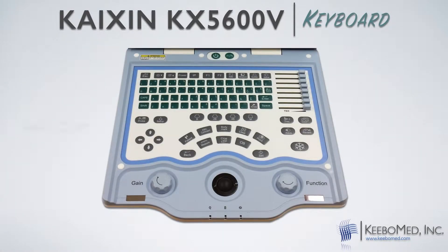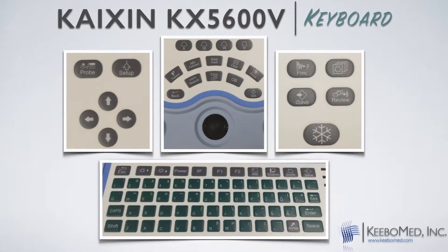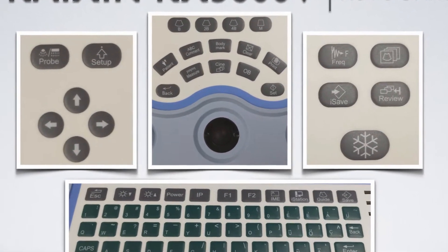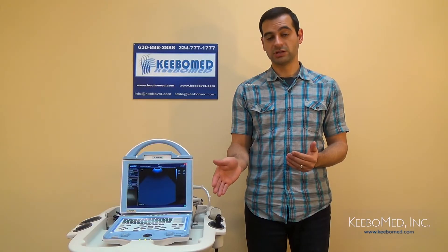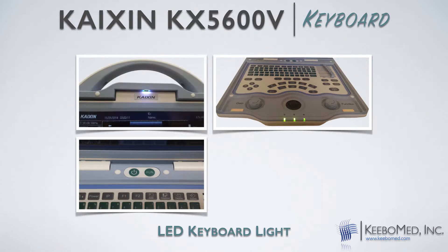The keyboard of the KX5600 was designed with many important features. It is anti-dust, anti-splash, and has many one-touch keys that are placed in an organized and simple way. This allows the KX5600 to be long-lasting and quick and easy to use during examinations. Some of the keys are image save, cine save, image review, and print. The keyboard is not backlit, but it does include an LED keyboard light that illuminates from the top of the screen down onto the keyboard, allowing for viewing even in darker conditions.